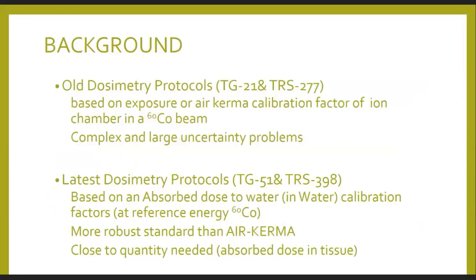these protocols. The latest protocols, although they have been in the field for more than 20 years, are based on an absorbed dose to water calibration factor. That means we're close to the quantity that needs to be measured, which is dose in tissue, and they are more robust, simpler, and less uncertain. They have less uncertainty than the old protocols.